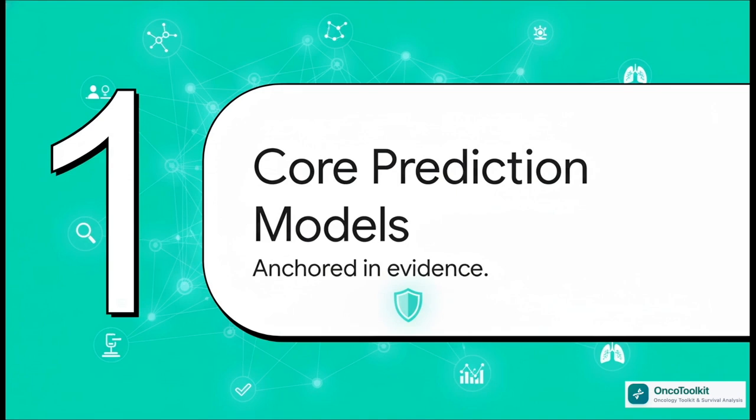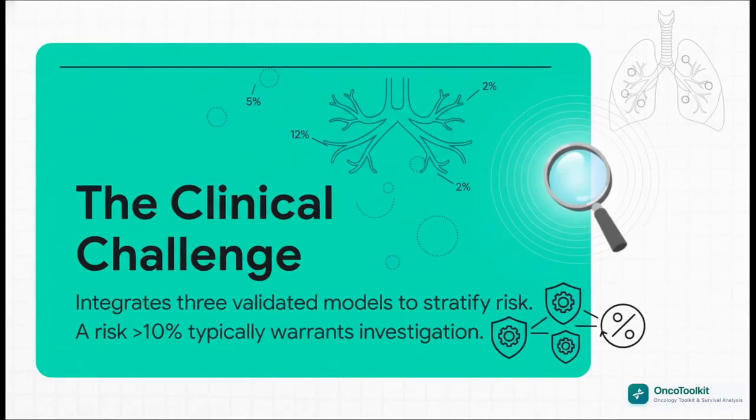Right, let's dive in. Before we even click a single button in the software, it is absolutely crucial we talk about the science underneath it all. I mean, this isn't just some magic algorithm. This entire tool is anchored in the validated prediction models that you and I already know and trust from the literature. So what's the fundamental problem we're trying to solve here?